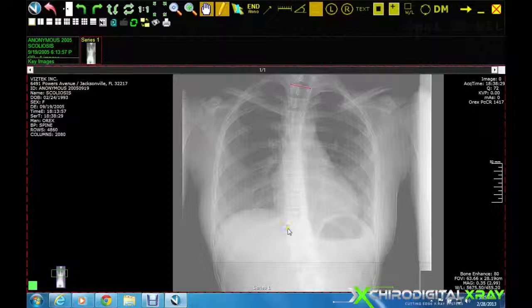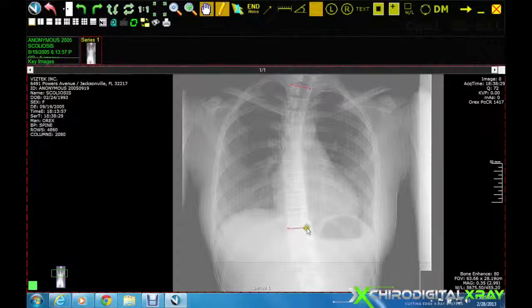Click on the left aspect of the inferior endplate of the lowest vertebra that contributes to the scoliosis. Then click on the right aspect of that same endplate.